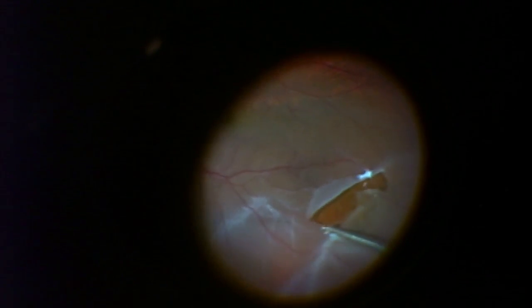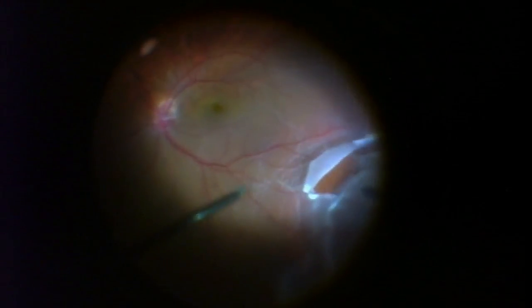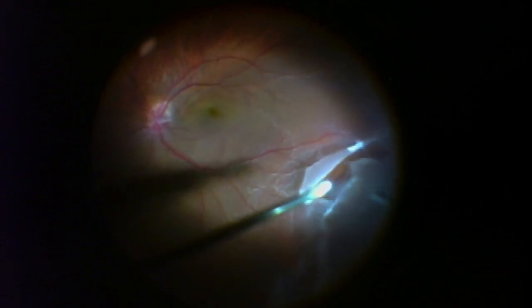I'm going to prepare to do what we call a fluid air exchange, which is actually removing the fluid underneath and in the middle of the eye in exchange for air. I'm marking the edges of the tear with diathermy so that I don't lose track of it — although I have to admit this tear is so large, it's going to be hard not to see. Sometimes when operating, tears are very small and when you do the fluid air exchange, they become very difficult to find. Here I've started the fluid air exchange and I'm literally just sucking out fluid from underneath the retina through the tear.